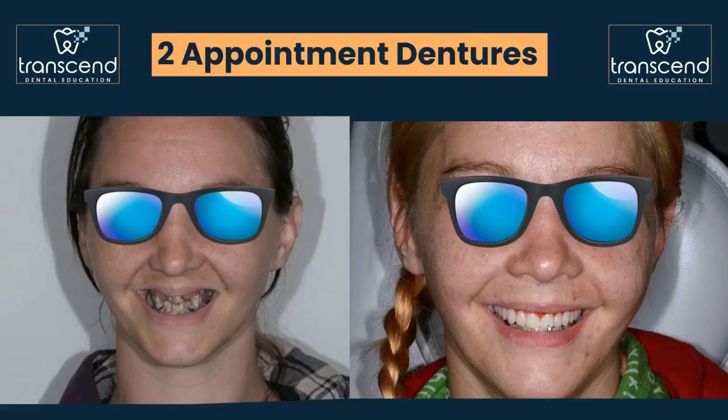And what I would point out is put aside all the implants and everything, right? That for sure ups the difficulty level. Think about you as just a general dentist. If you have the capability to deliver results like this, and essentially that would have been 2 appointments, right? We had just acquired data one day. When we figured out we couldn't immediate load, we just took that very data, designed the digital denture and delivered it the next.